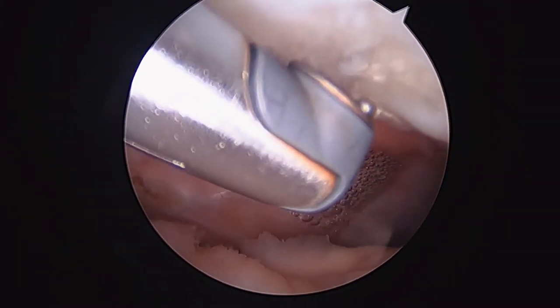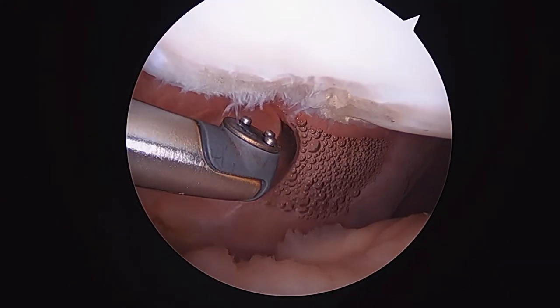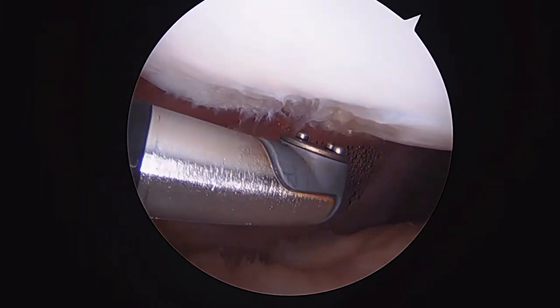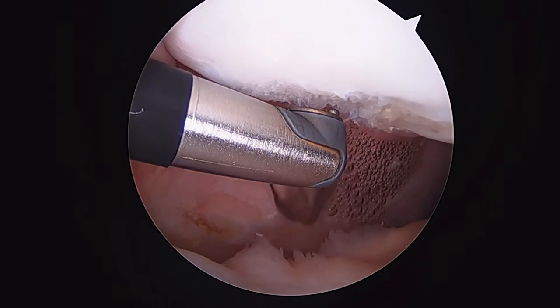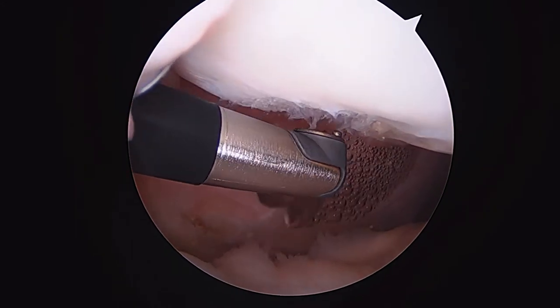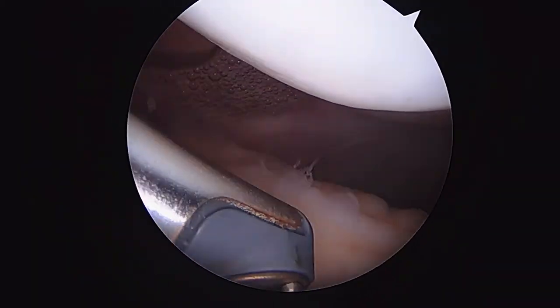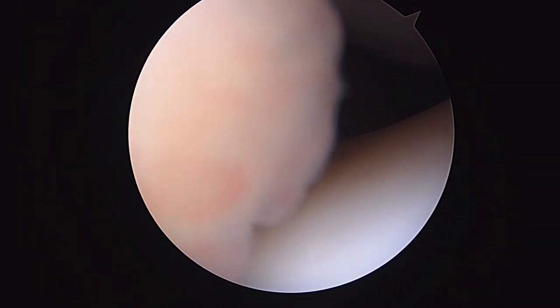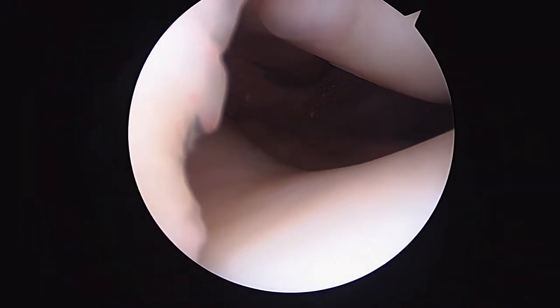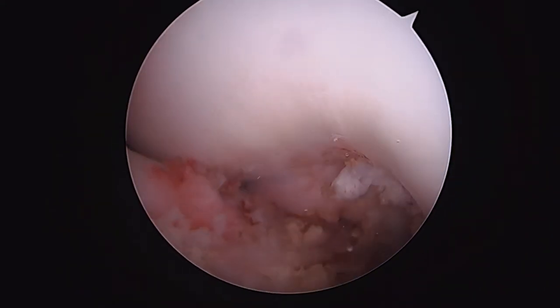We're looking at the patella — you had a little flap here we had to debride. I'm just making sure there's nothing else loose hanging down. That looks pretty stable now. The rest of the patellar cartilage looks pretty good. We can look down at the trochlea, which is the notch that the patella glides in — this looks good all the way down to the front of the knee. The trochlea cartilage looks pretty good.